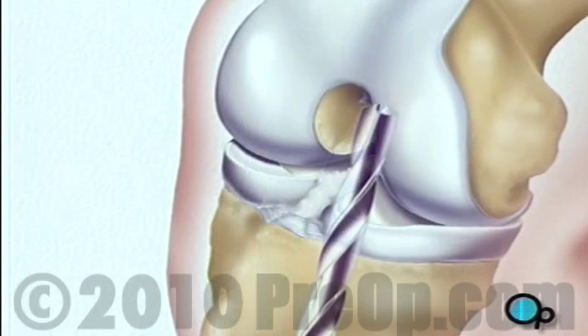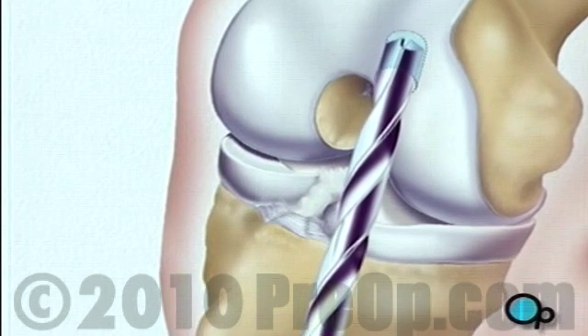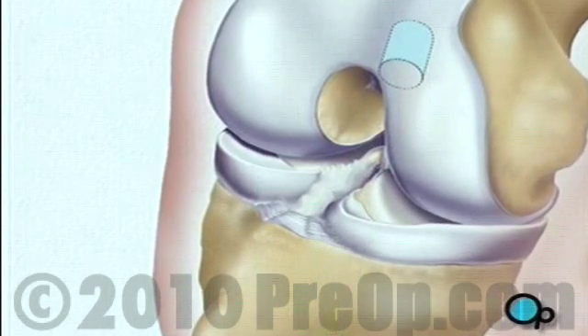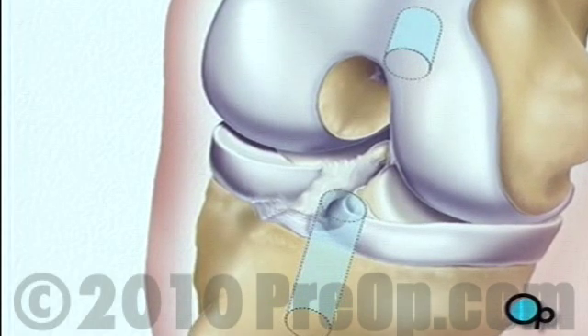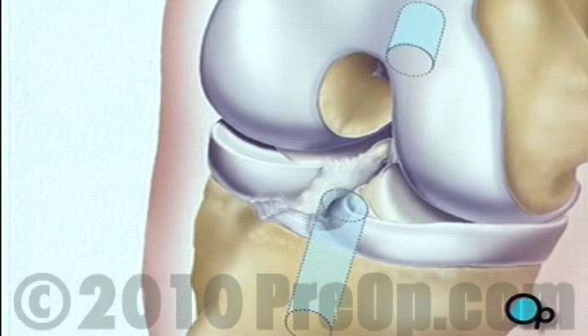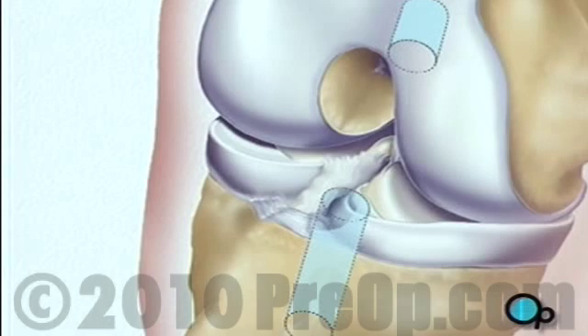Next, the team drills a hole in the end of the thigh bone and another in the top of the shin. These holes become the sockets for the bony ends of the tendon graft taken at the beginning of the procedure. The ligament graft is then inserted into place.